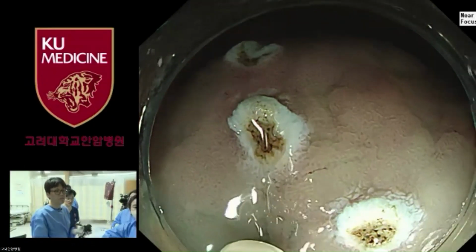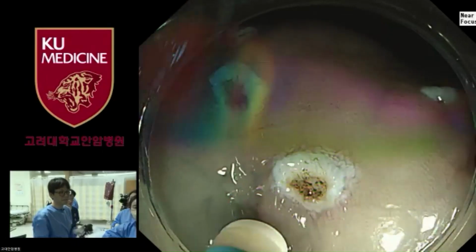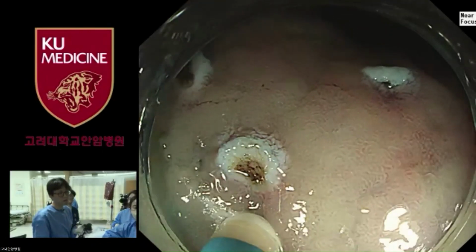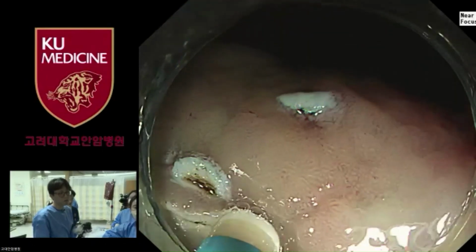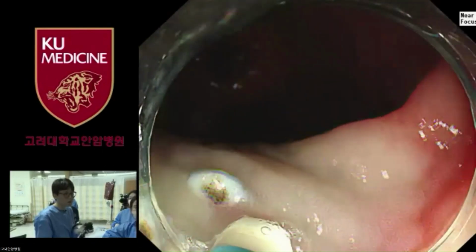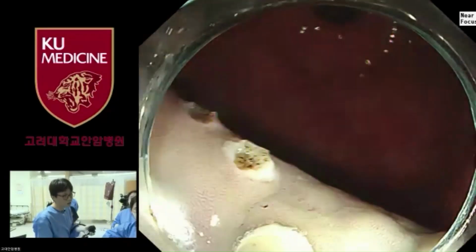But usually, in our center, we use only normal saline solution. But today is a live demonstration, so we have to save some time. So we decided to mix the hyaluronic acid to maintain the submucosal cushion. Yeah, okay. It depends on the region's characteristics and the endoscopist's preference, right? Yes, that's right. Okay, thank you.